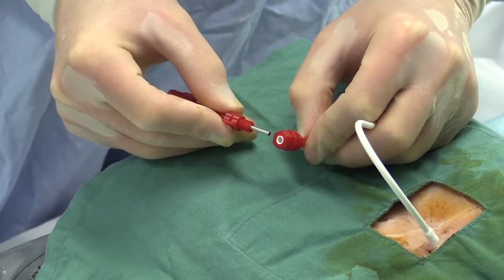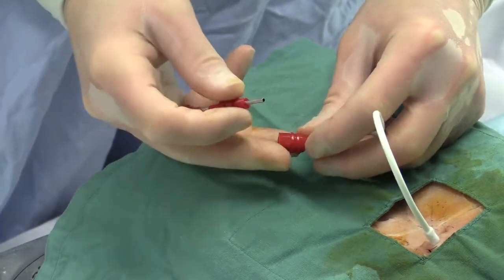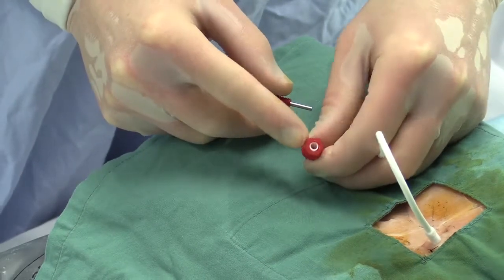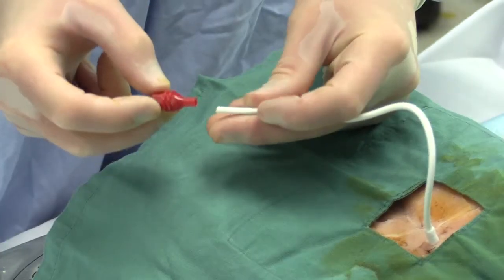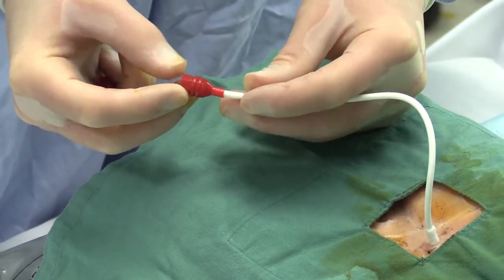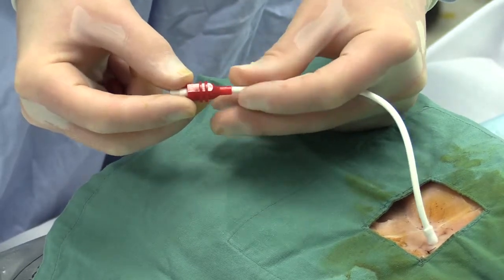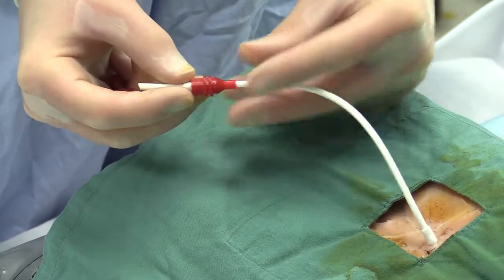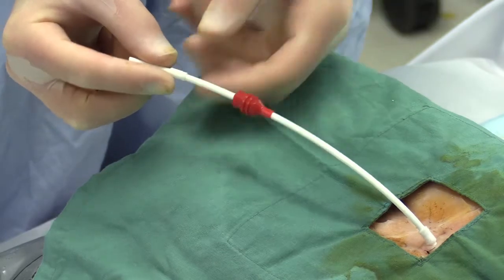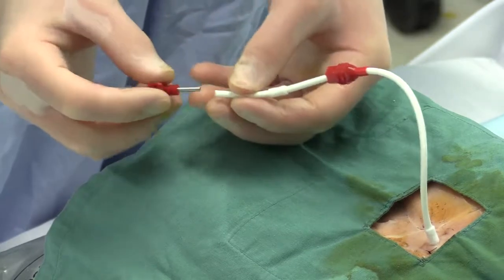There is a small white silastic tubing which comes in the cap, and care should be taken not to lose this during the assembly. This cap, with its tip facing towards the inserted end, should be placed down the tubing. Again, careful not to displace or lose that white tubing from inside it. Notice the tip is facing the patient. The tubing is there.